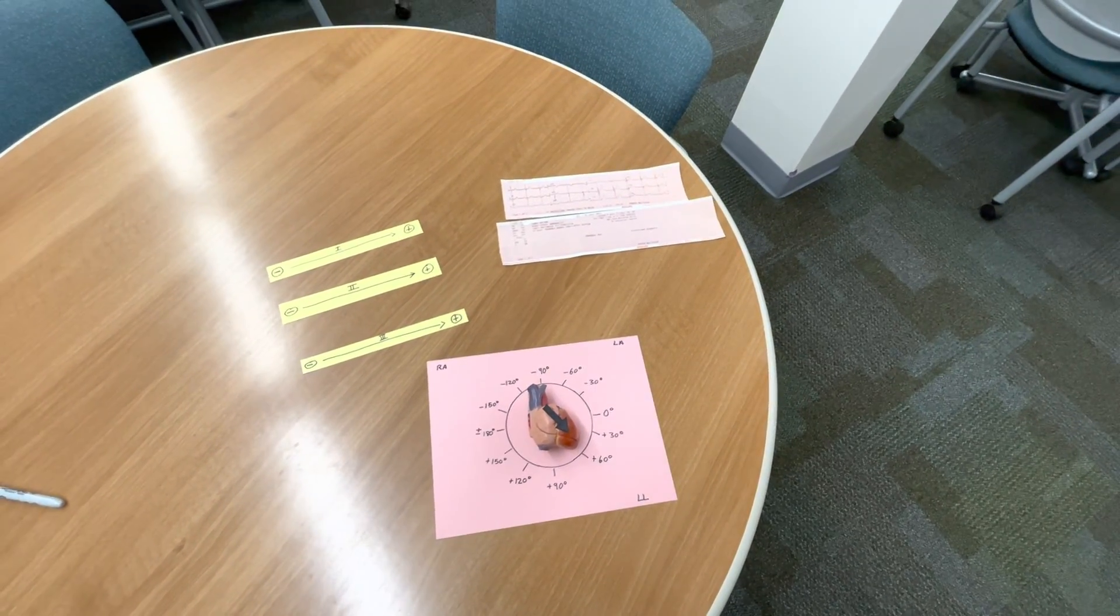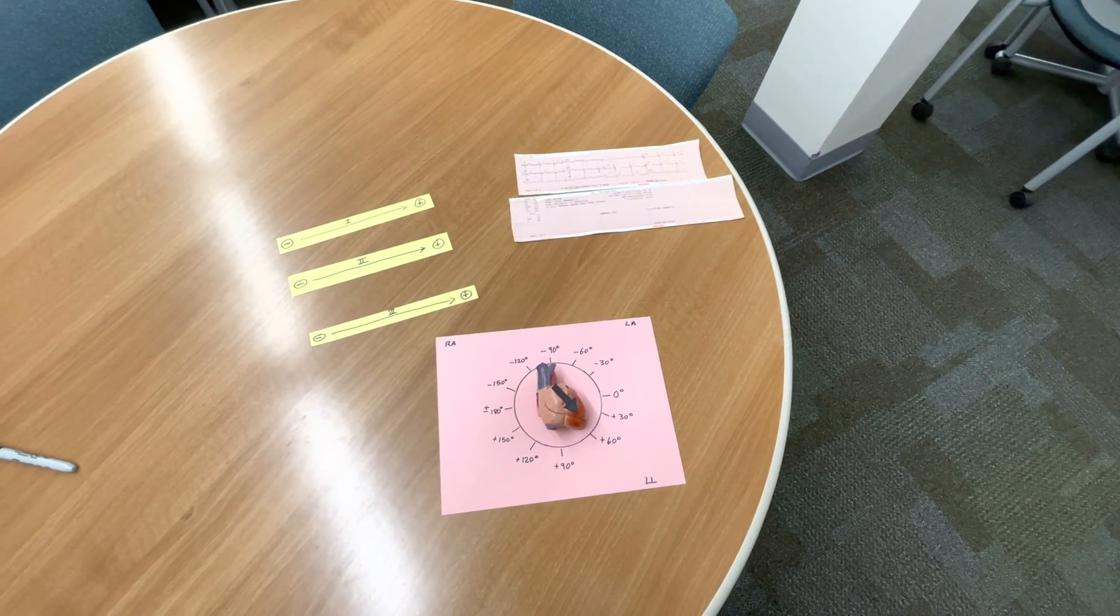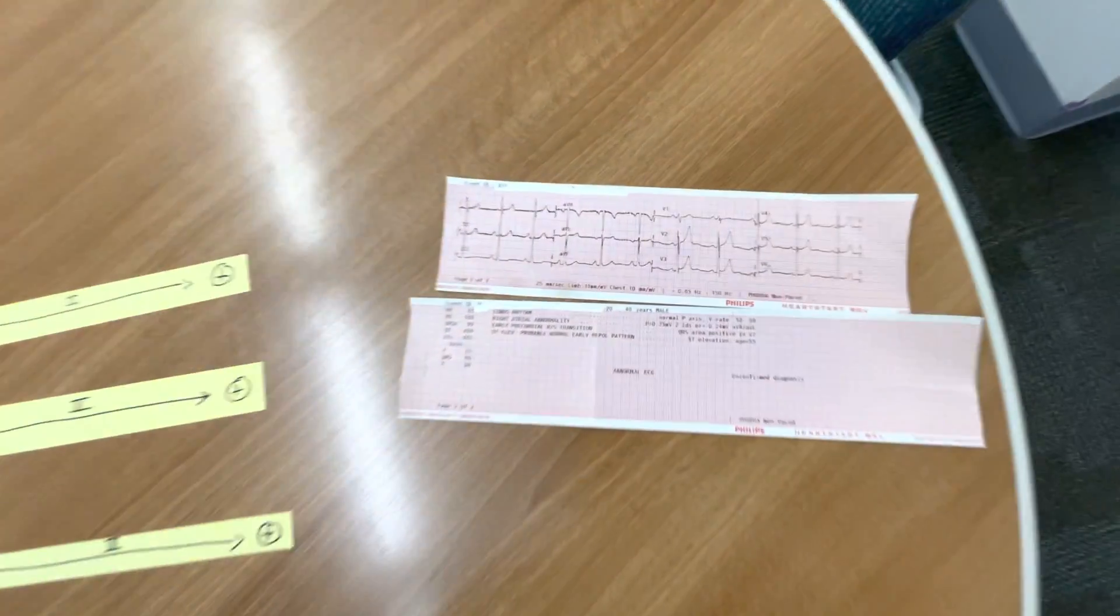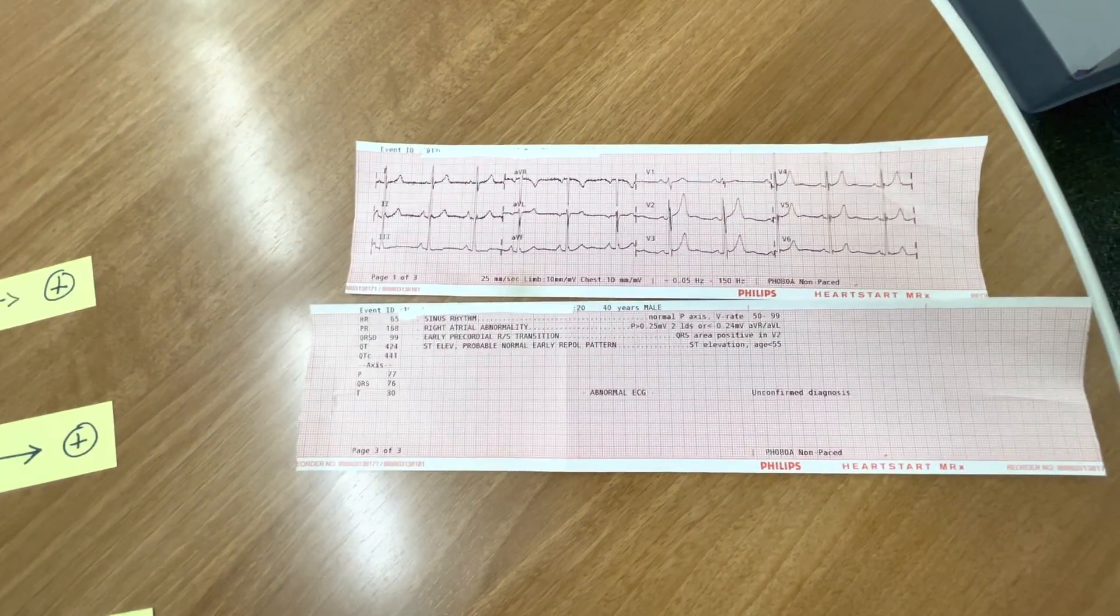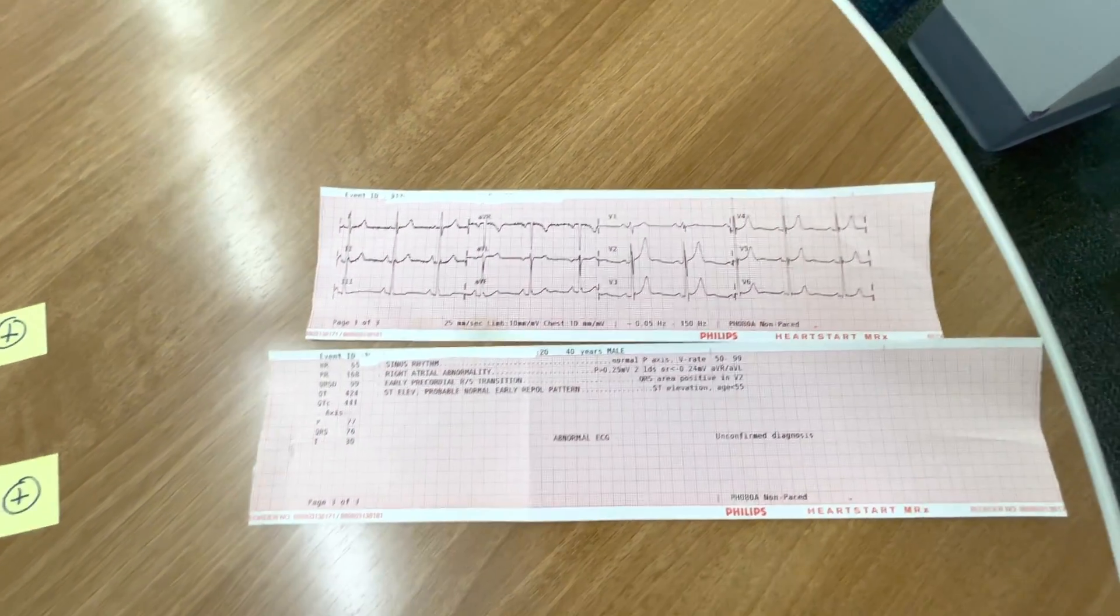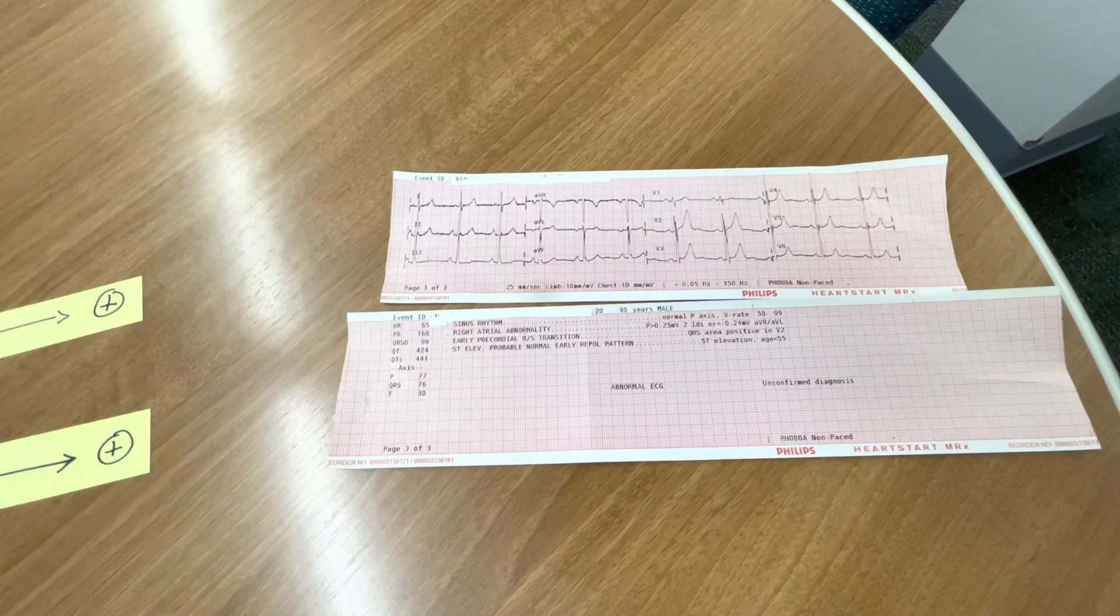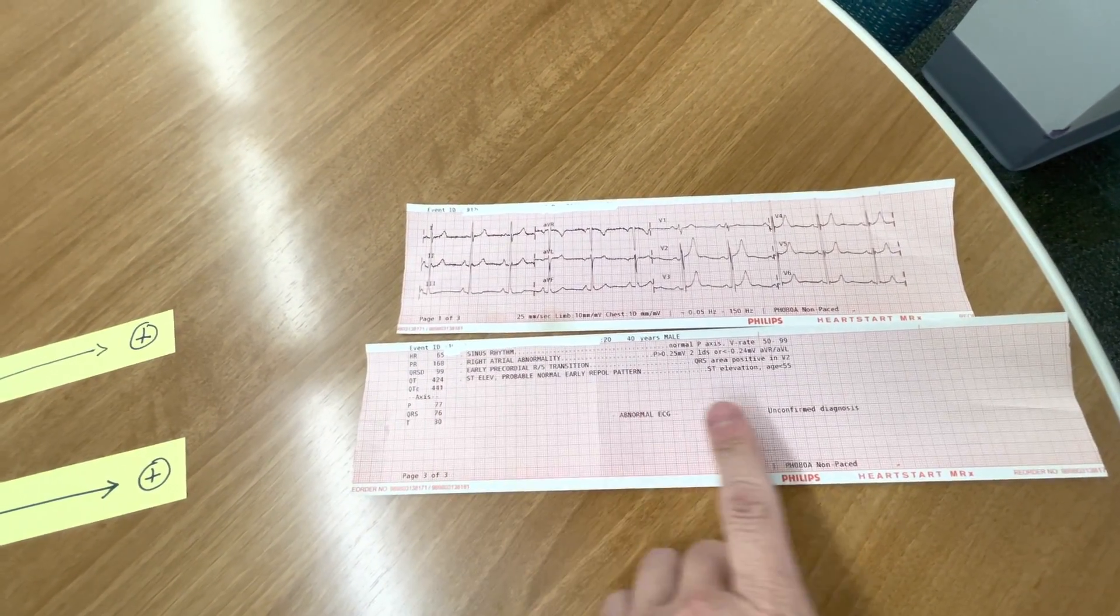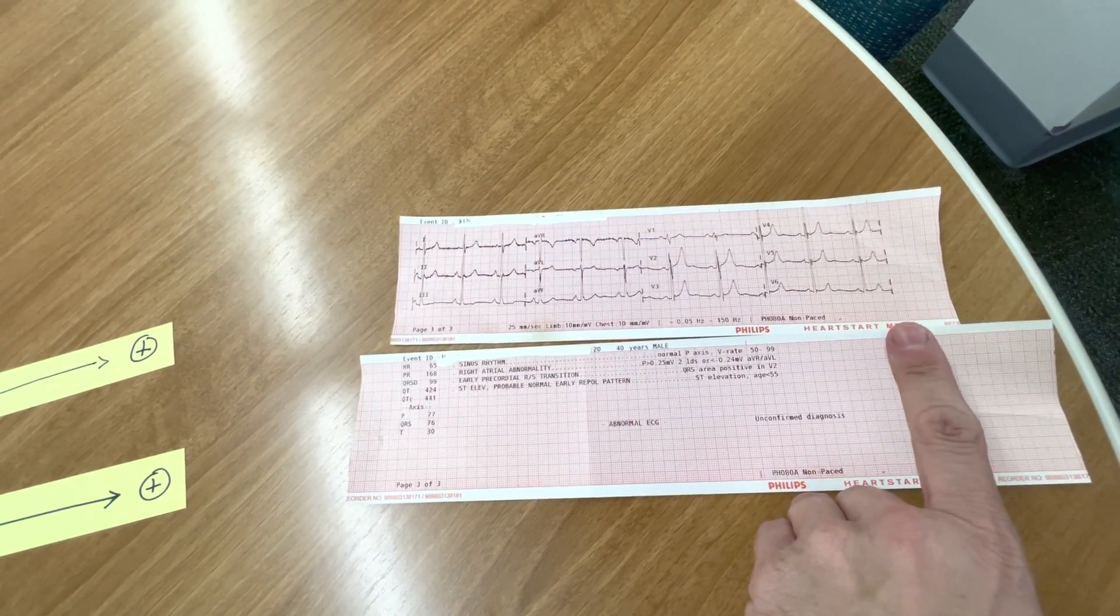Good day, everybody. This is Chris of the Ancient Scholar, and I'd like to do a quick video on axis deviation, how we determine it, why it's important. So, you get a 12-lead ECG on somebody. This happens to be a 12-lead ECG of me from a few years ago, back when I was in my 30s.